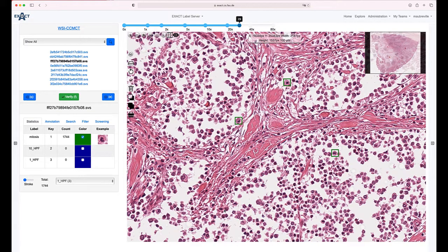What you've learned up to now is what mitosis is and that it needs to be counted. I didn't tell you where it needs to be counted though. Many grading schemes require the pathologists to count wherever there's the most mitotic figures. Now that's kind of hard to estimate. If we see in this image, there's 3 mitotic figures, 1, 2, and 3.